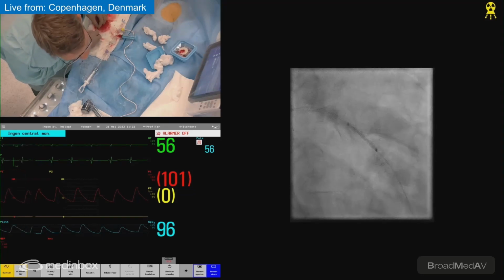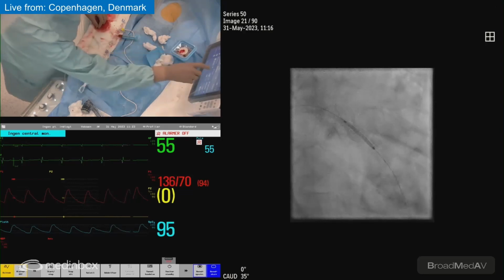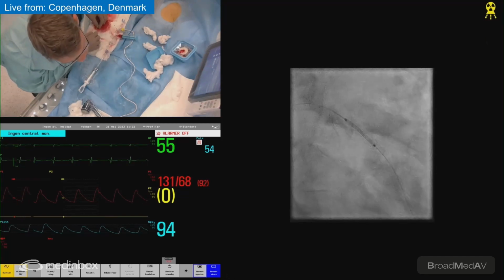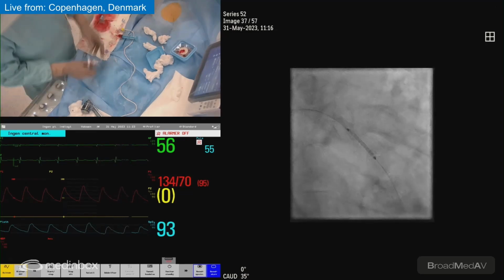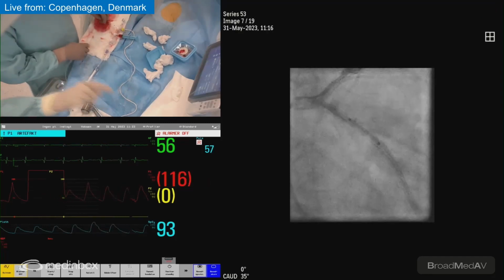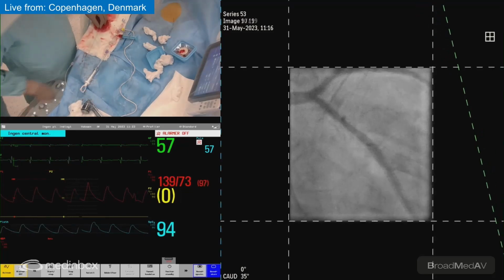Isn't that where you want it ended? Yeah, that's fine. You can't retract it further. Now you don't have any overlay. Yeah, now we have just one. Now it went down further. Too much.